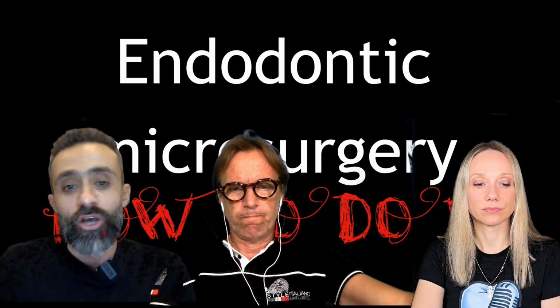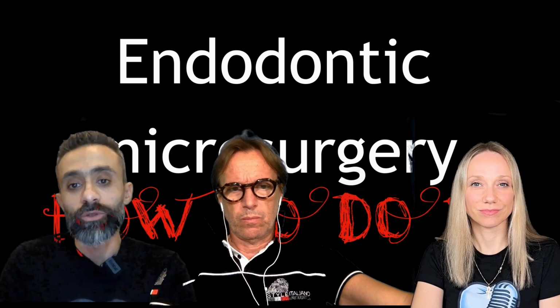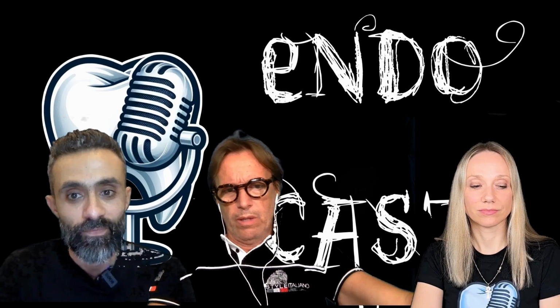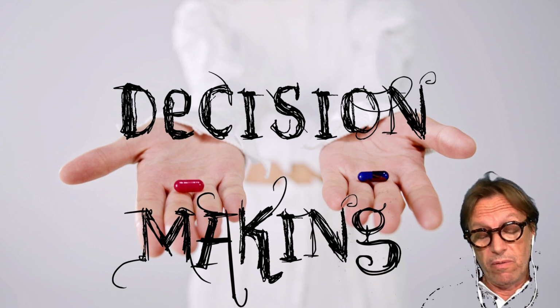So, in the beginning, when we discuss the workflow of apical microsurgery, I guess our colleagues would like to know your perspective, Fabio, on the decision making before executing the surgery. The decision making is the first step, of course, of our treatment, and in theory, we should discuss it for hours. Anyway, I know that for many, the first step is the non-surgical retreatment, but this is a big mistake in my opinion, because it depends on the level of the previous treatment.